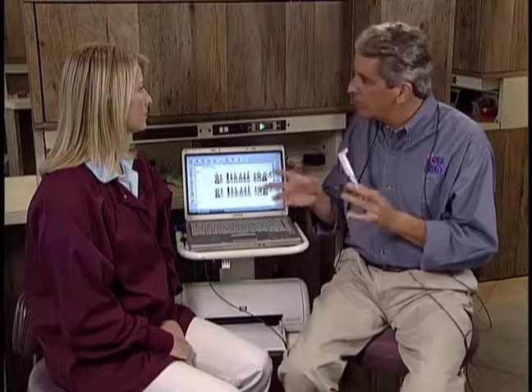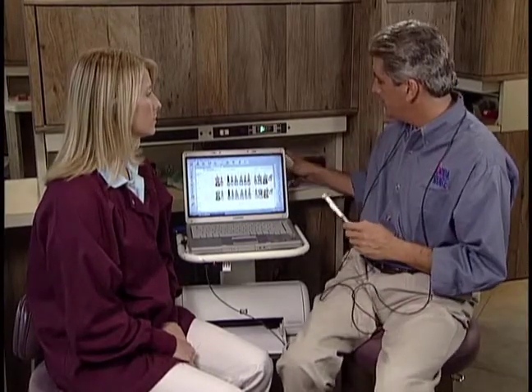Now, special deal with recession. I can do recession at one site on the straight buckle, 2 sites, 1 buckle, 1 palatal, or do 6 sites per tooth and map the recession. If I do 6 sites per tooth, then I can do pocket depth and recession in the same pass. We call it speed pass, and that's set in the initial visit settings. I don't start there. It's a little more technical to do, and I'll show it to you after a while. Right now I'm only set to 1 site on the straight buckle.